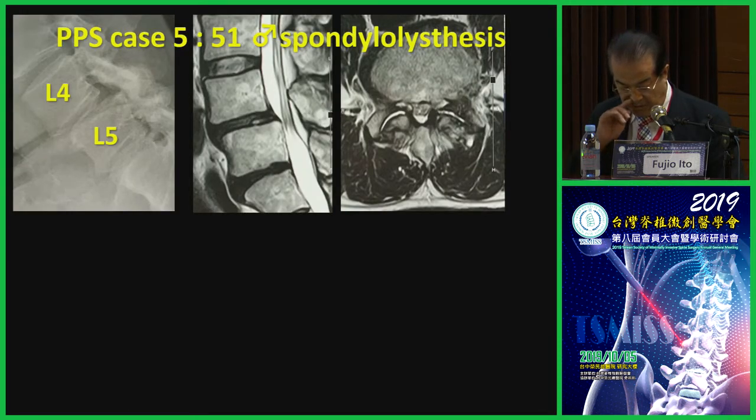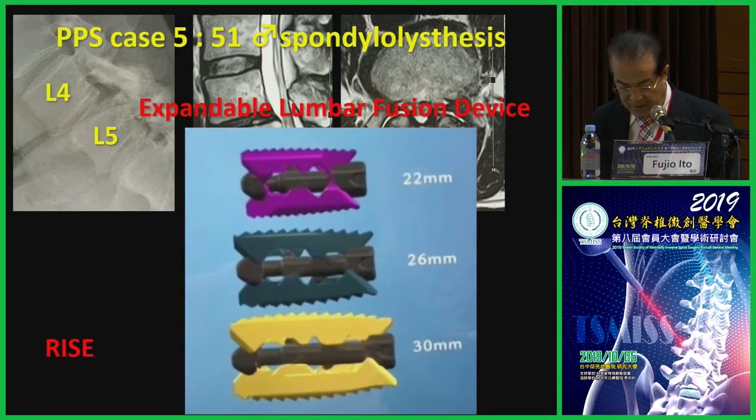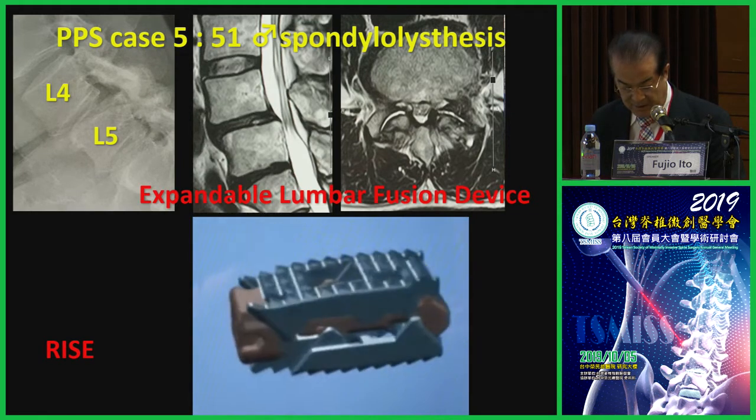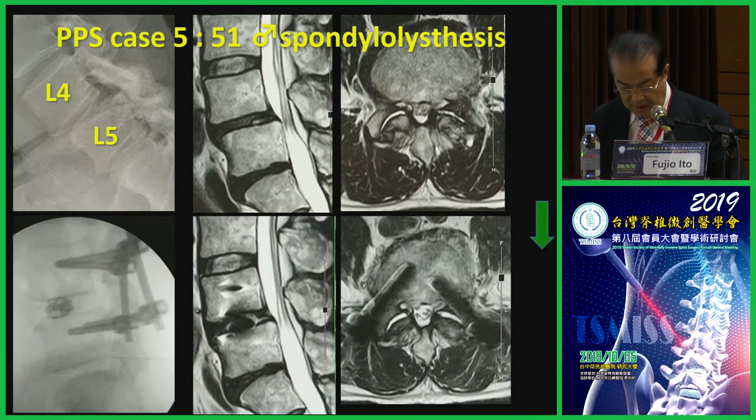This patient is a 51-year-old male with spondylolisthesis. The expandable lumbar fusion device was inserted into the intervertebral space at a contracted height. When it is expanded in the disc space, the implant can lift the upper and lower end plates to the appropriate height. Postoperative images show good alignment.